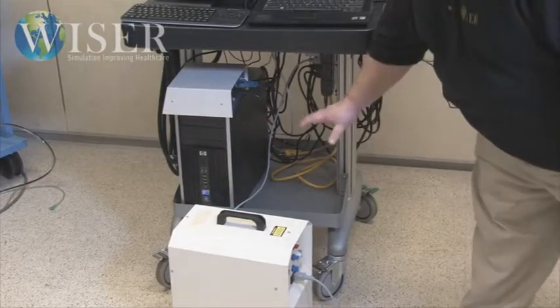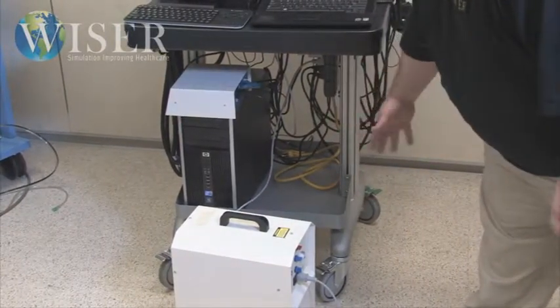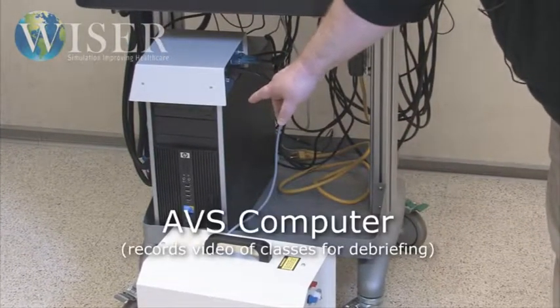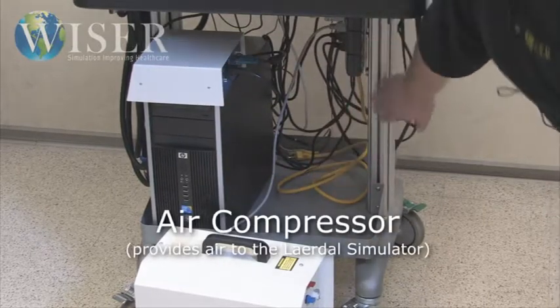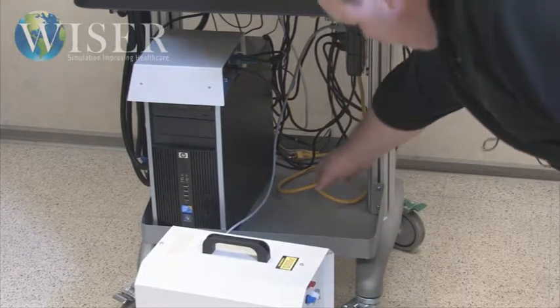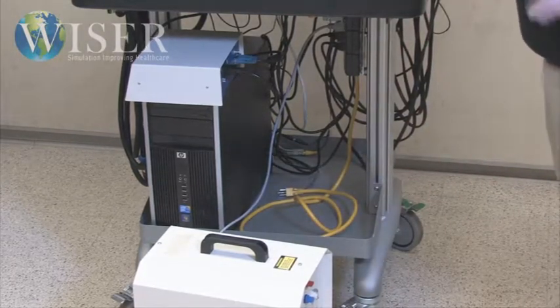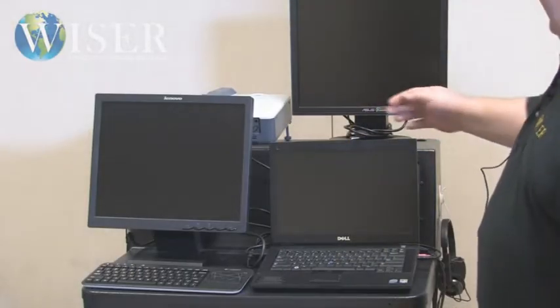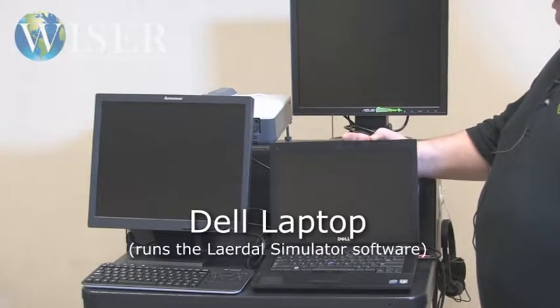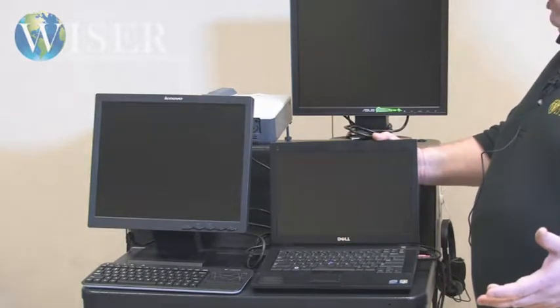First thing I'm going to show you on the cart is the lower shelf. I've removed the air compressor so you can actually see in here. There's not a lot of space, but there's just enough to fit the AVS computer, a link box, and air compressor. We have power for everything built right into the system, and this yellow cable connects to a wall plug and supplies power for the whole cart. When she purchased the cart, it did come with a laptop, which we use to run the simulator software — Lairdall's SimBaby, SimMan, or whatever else she might need.